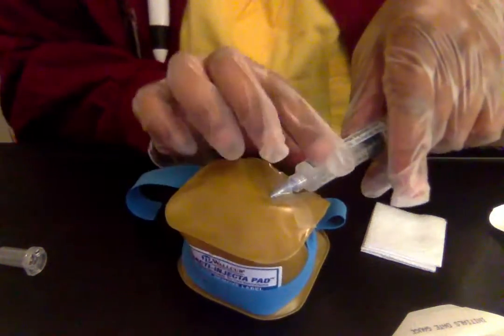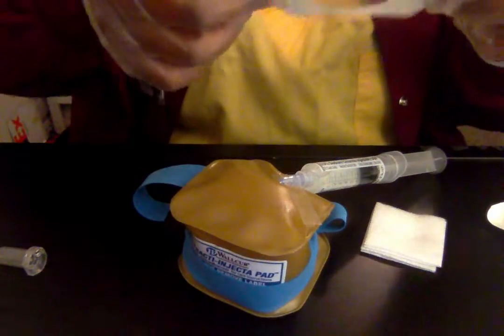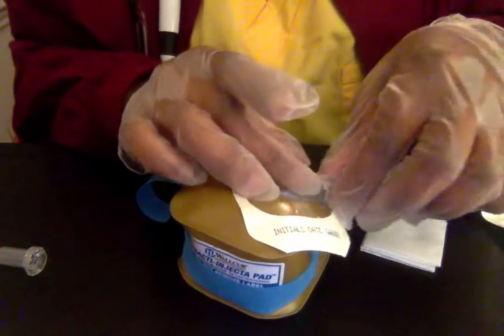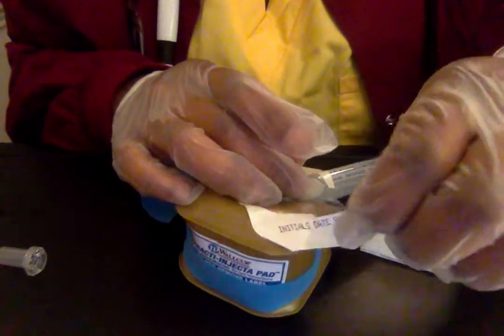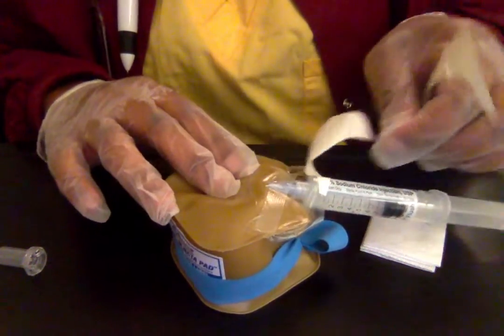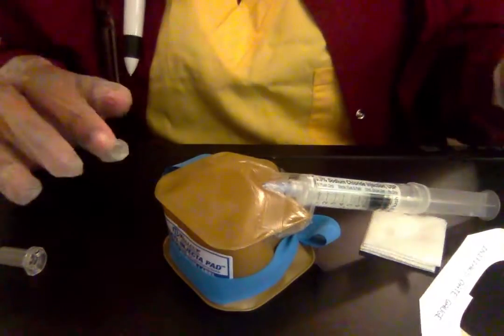Now that we've got that secure, I would take my Tegaderm and we're just going to do this to secure that IV. At this point, I would have the saline lock after I flushed it. I would then connect my fluids, but since we don't have any fluids right now, we're just going to initiate that IV. Also when I'm flushing, I need to ask the patient if they are feeling any burning, any coolness, just what type of sensation they're feeling. We don't want it to be a burning feeling. We want it to be a cool sensation.